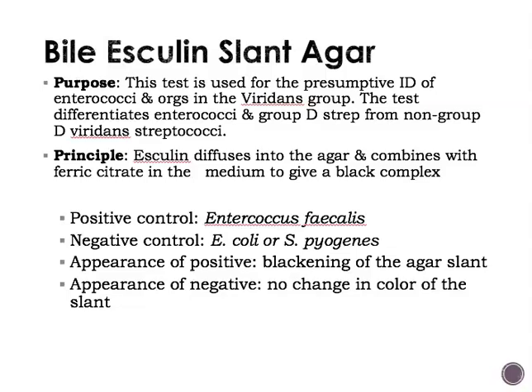This one gets incubated overnight, and the next day you're looking for a positive result, which would be that the slant, the agar, turns black. No change in the color of the agar is negative. So our control organisms, Enterococcus faecalis is our positive control. Negative would be E. coli or Strep pyogenes.